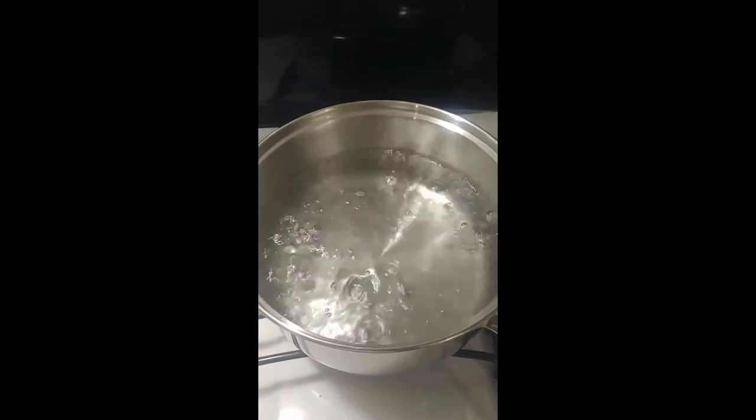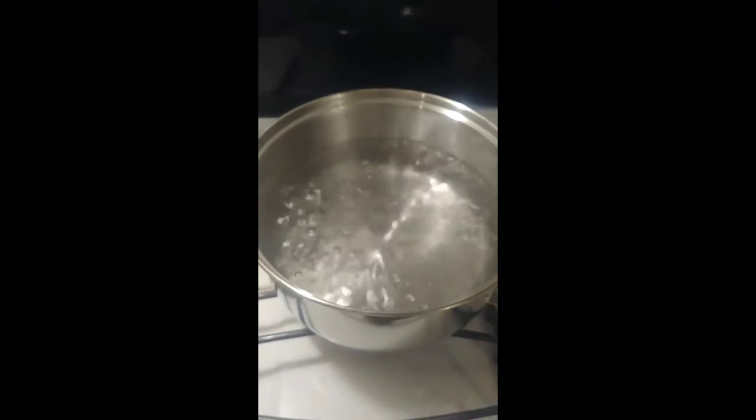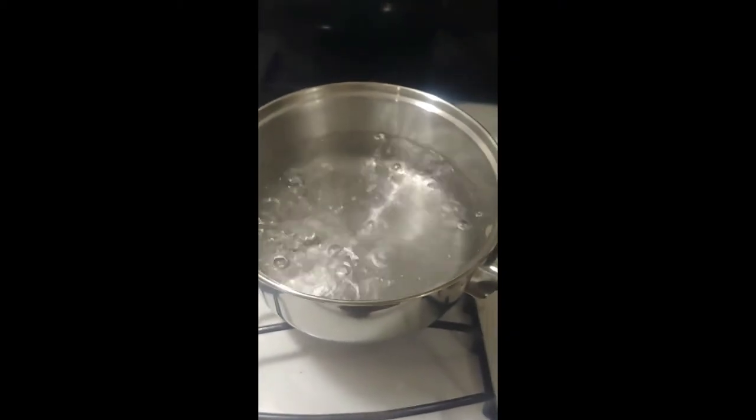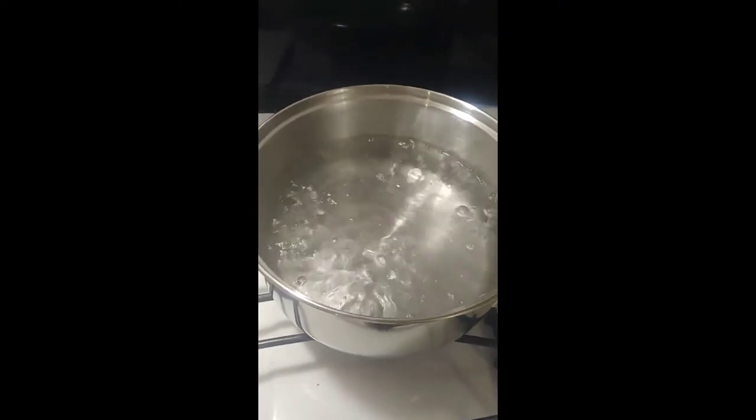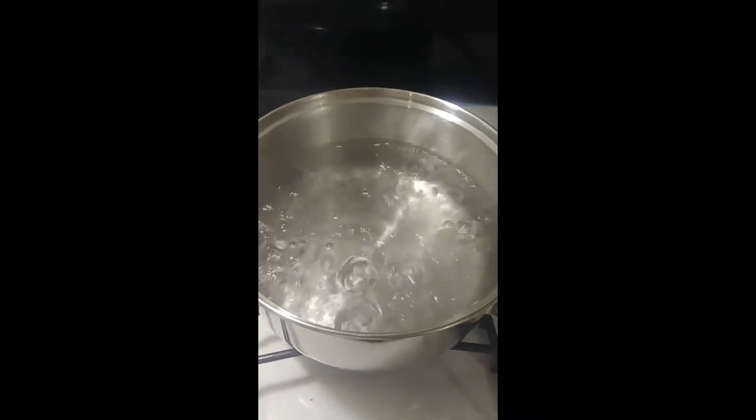This video is going to be about how to heat and apply comfort lining. First off, you want to get a small pot and you want to boil some water. This is easy — just pretend you're going to be boiling some tea.